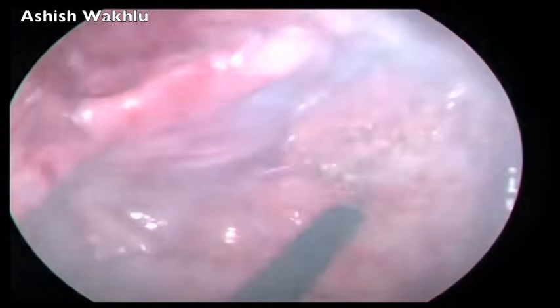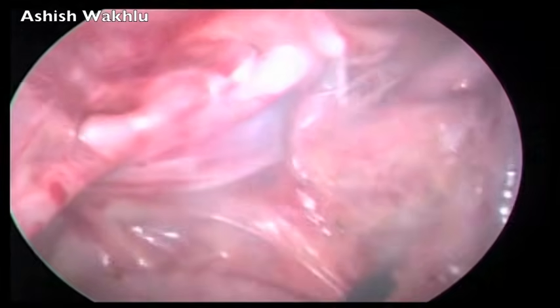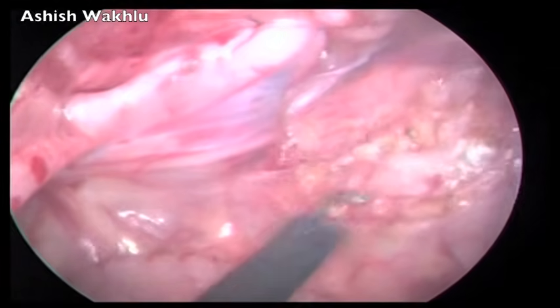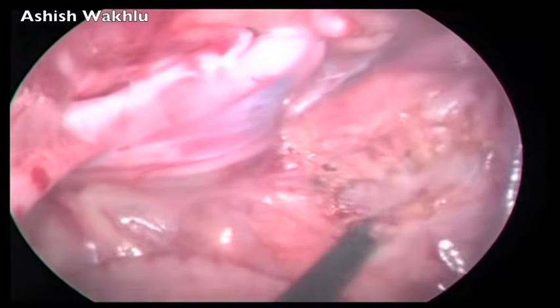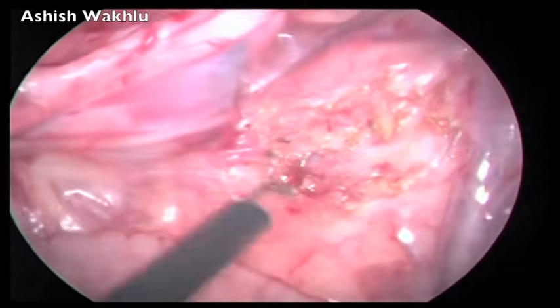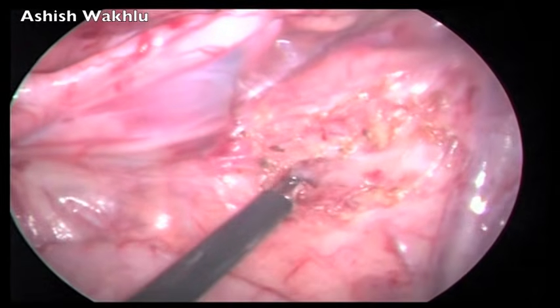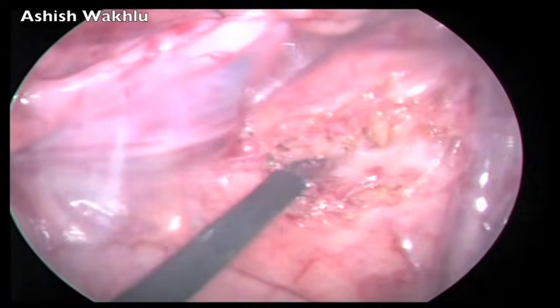The dissection was then brought back to the left side, and in a similar manner, alternating between the right and left sides, the back wall of the rectum was delineated, a plane opened up for entering the pelvis, and a passage dissected through the mesentery of the bowel.